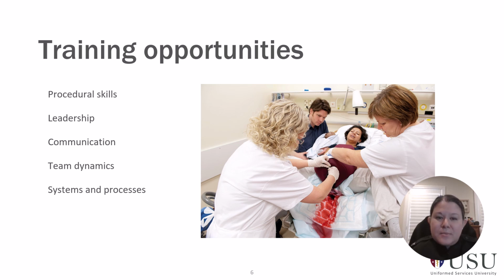So thinking about that as a potential training opportunity. And then what are the systems and processes that you may wish to evaluate and improve? Certainly, as we mentioned, doing in situ simulation has some benefits in terms of being able to use your actual systems and processes. But then you also need to consider the impact on the team.